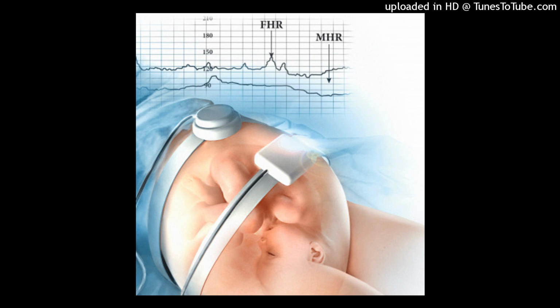Maternal heart rate may be recorded if ultrasound transducer is placed over maternal arterial vessels, such as the aorta. TOCO transducer provides information limited to frequency, duration, and relaxation time of uterine contractions, but cannot accurately assess strength or intensity of uterine contractions. Obese women and preterm or multifetal gestations may be difficult to monitor.